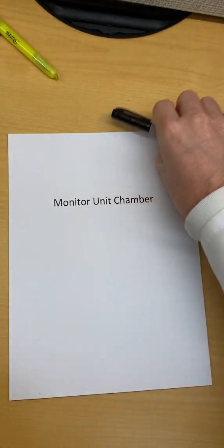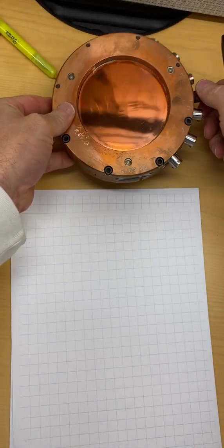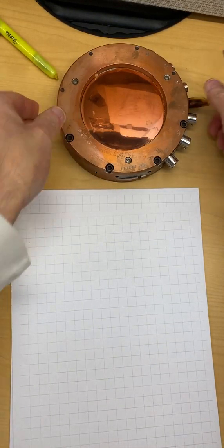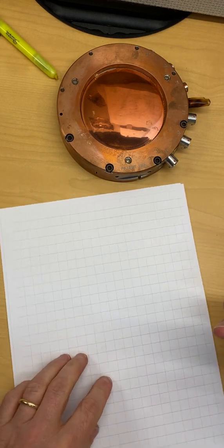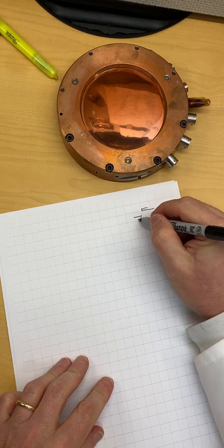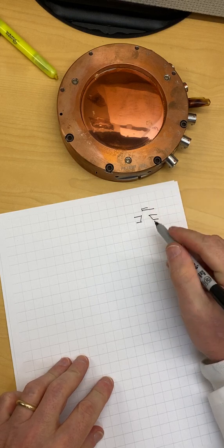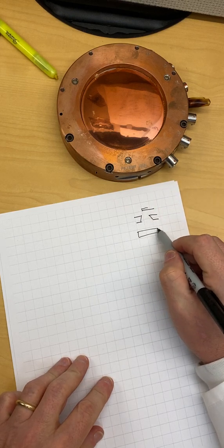An interesting thing about the monitor chamber is that they are ionization chambers. I think these run at about 500 volts. They sit up high in the linac, so you have your target, your primary collimator, and then below that you'll have your monitor chamber.